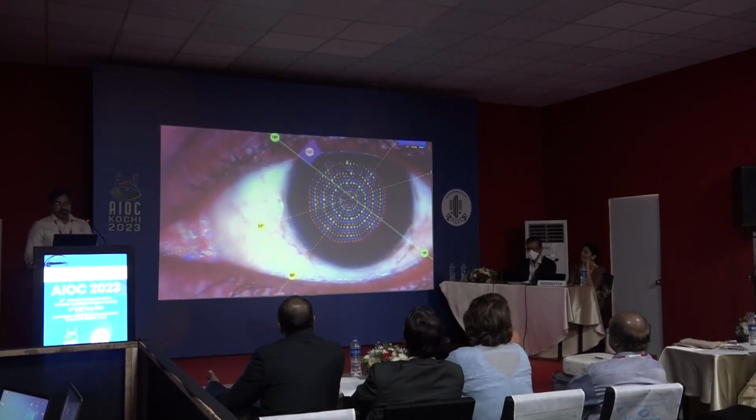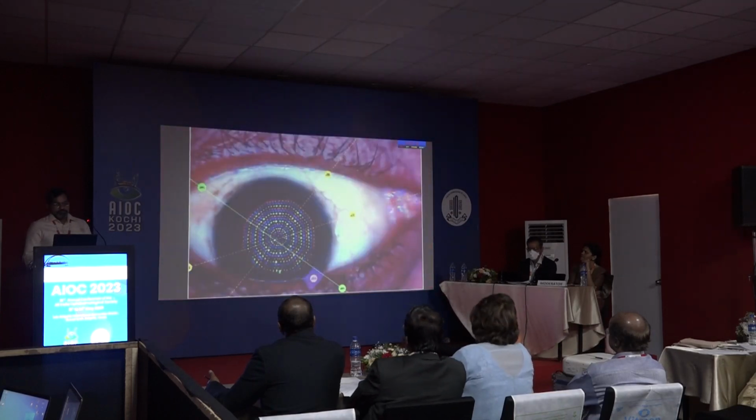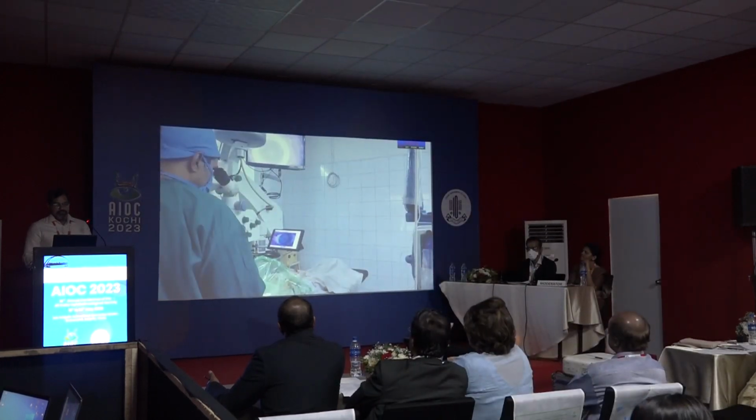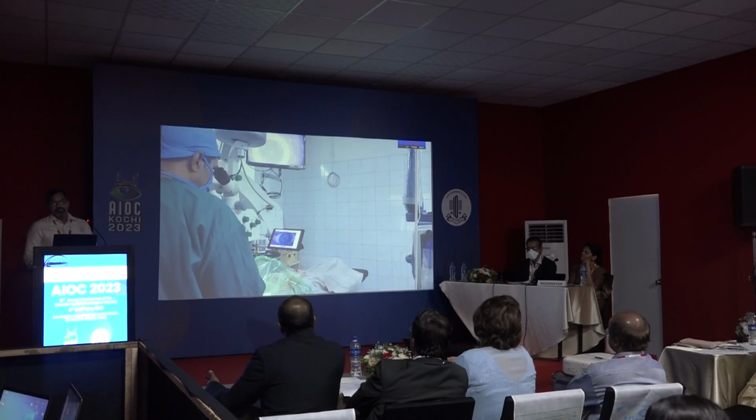Identify two prominent limbal structures. Click on them. The system will display their axis. It is 17 and 50 degrees in this case. Save the picture, rotate it as needed, and use it intraoperatively to identify landmark points under the microscope.